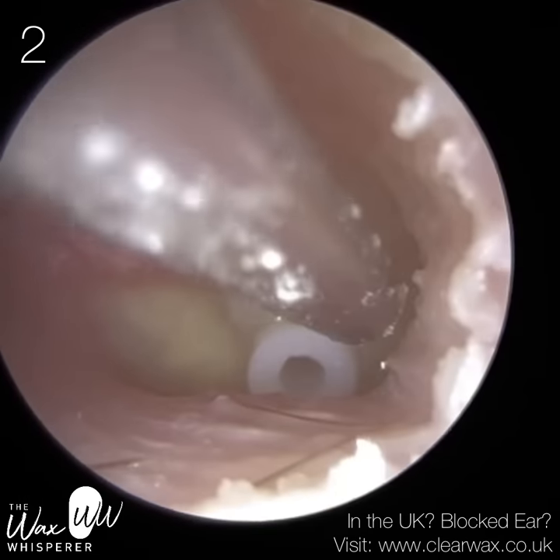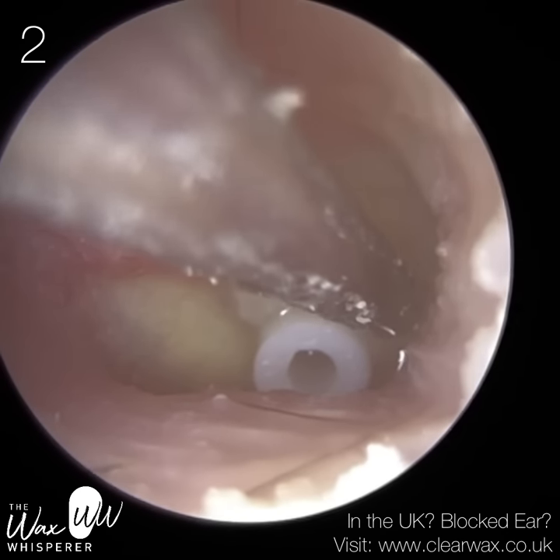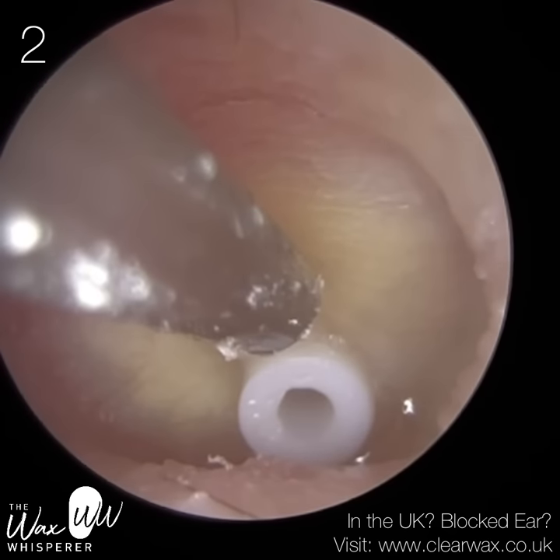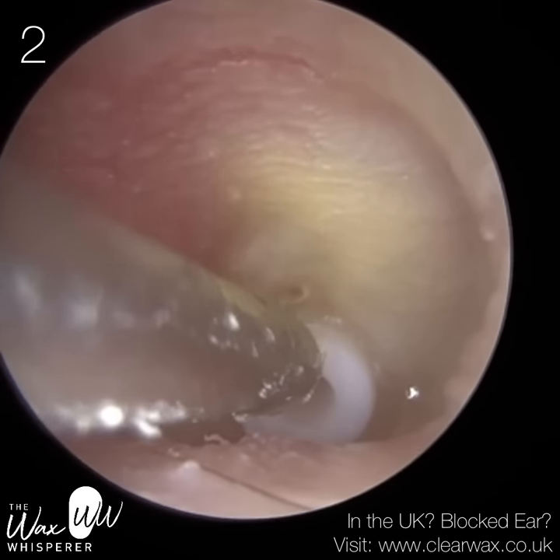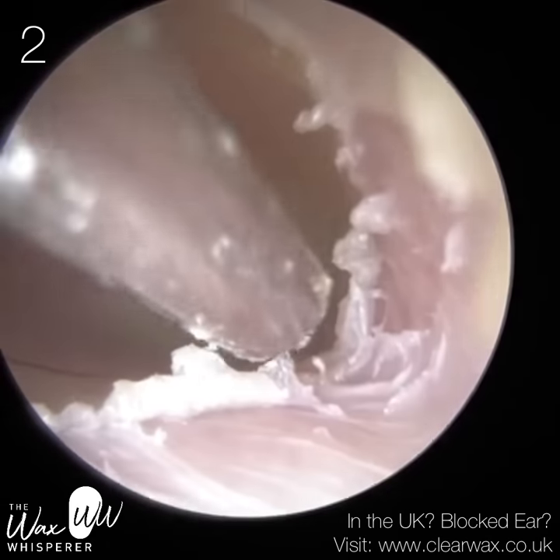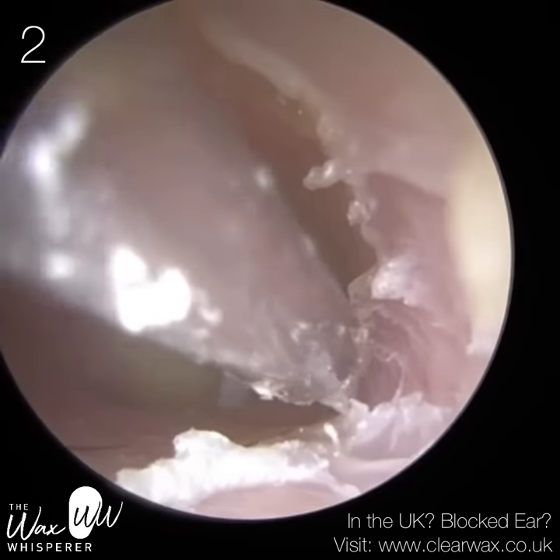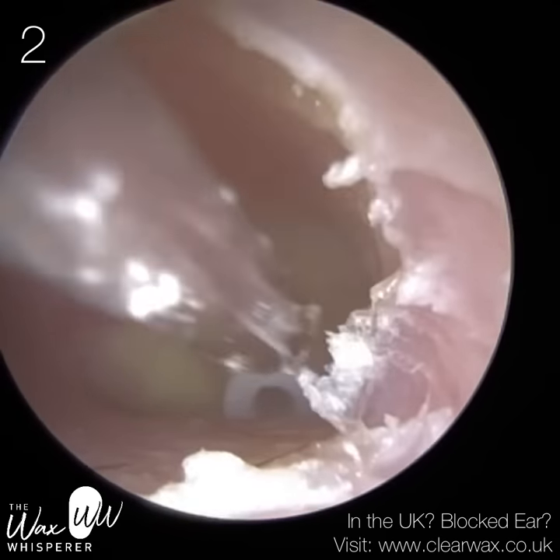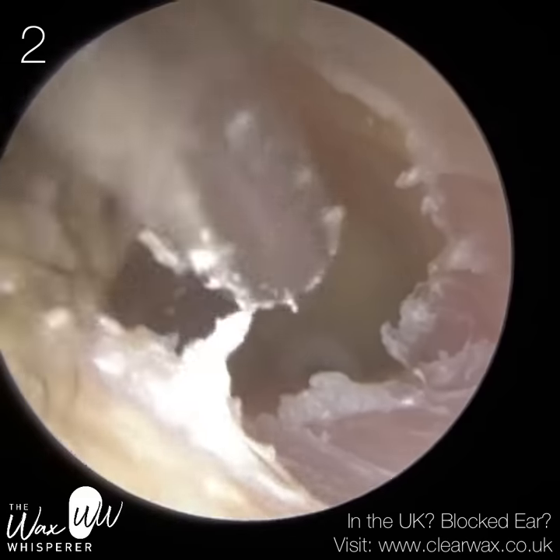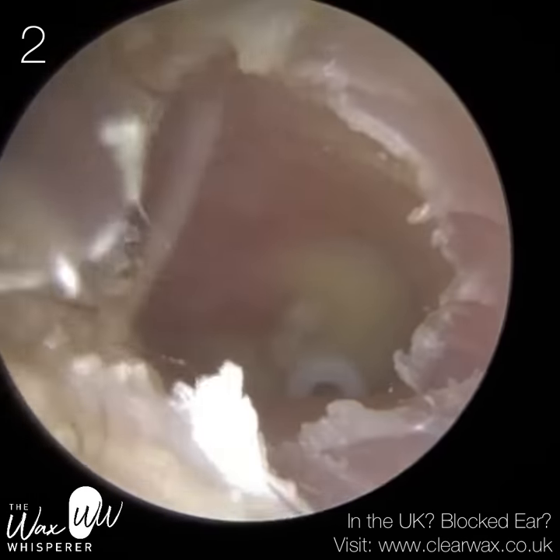What makes it difficult — there are three things. First, the entrance of the ear is really narrow. Second, the ear canal significantly narrows as well; you can see there's a V-shape, and where the grommet is, the ear canal just narrows there. Third, the grommet is hiding behind the floor of the ear canal near the eardrum — what we call an inferior recess, a little trench and basin. The grommet is located inside that inferior recess, which makes it physically difficult to position the suction probe at its entrance without making contact with the floor of the ear canal.